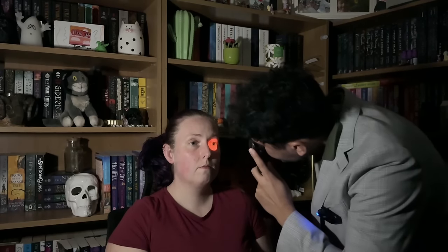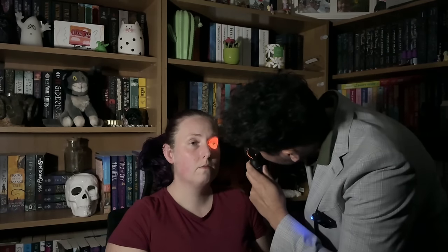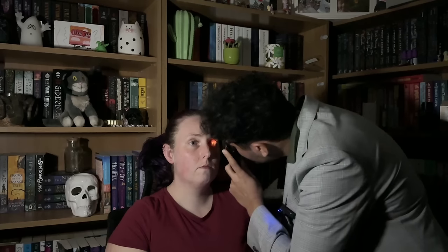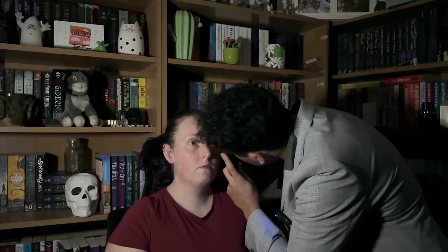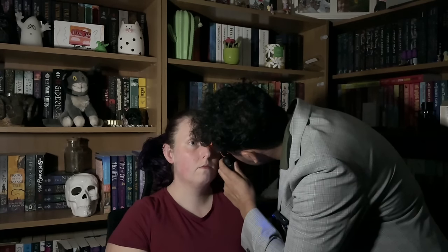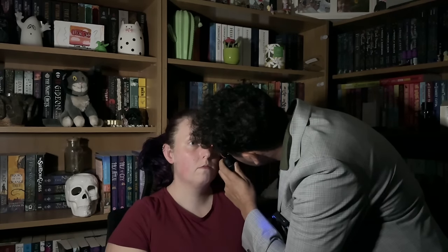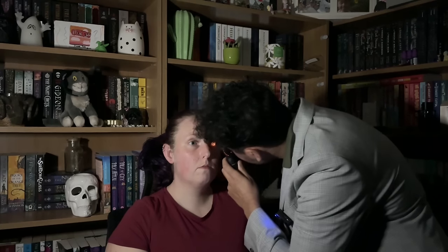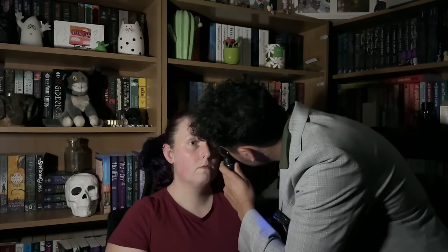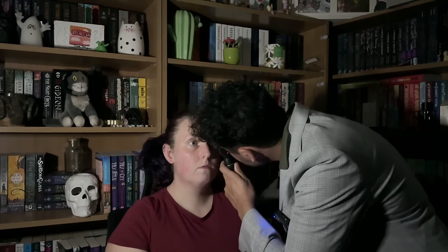A little closer, looking through the lens and at the vitreous humour. Looking straight ahead at one point — come in. Focus on the optic nerve, keep the eye very still at one point. I'll make an assessment of the optic nerve first, and then we can evaluate the macula. Looking into the light for me now — just watch the brightness of the light, just turn it down slightly.